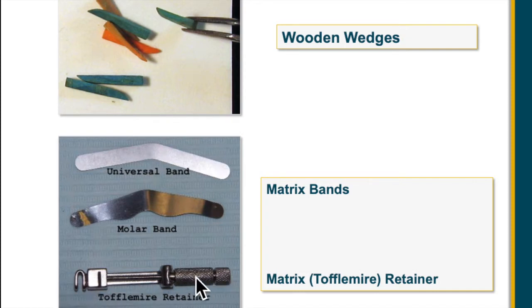These can be very tricky for dental assistants. For some reason, the Tofflemire retainer can be very difficult for many assistants to understand. So the best way to learn to understand them is to just pick one up and start playing with it and figure out how it works.